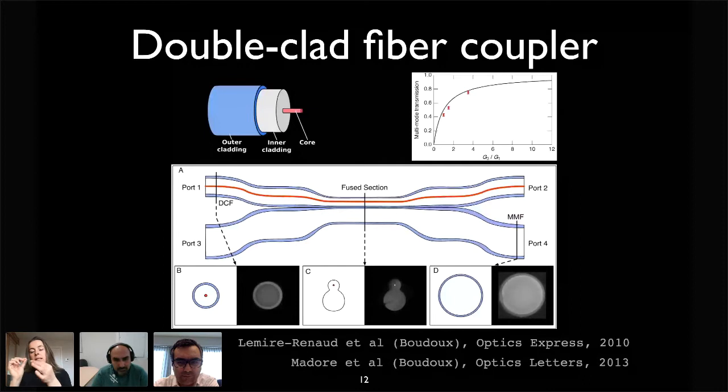And as I said, this is not an easy task because the fiber optic is essentially the size of my hair. And this has three different areas, so the core is 9 micron and the inner cladding is 100 micron and the outer cladding is 125, how do you only talk to the core or the inner cladding without talking to the other sections?